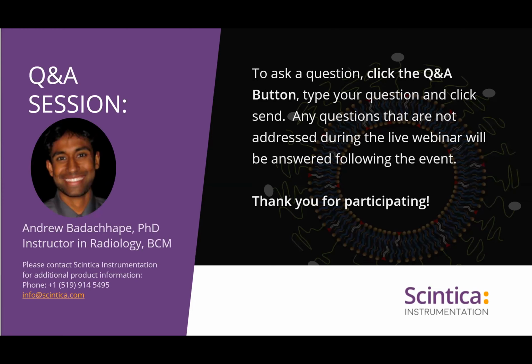You've talked, in the latter part of your presentation, about some of the other applications, but outside of placental and tumor imaging, what other applications do you see capable for this liposomal gadolinium, Andrew? So we've mentioned some of the tumor imaging. We're also interested in other vascular imaging, particularly cardiac imaging, looking at leak patterns or disruption of larger blood vessels, like the descending aorta or other ones.